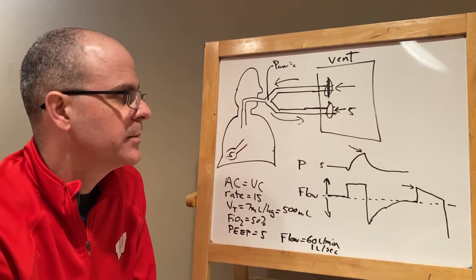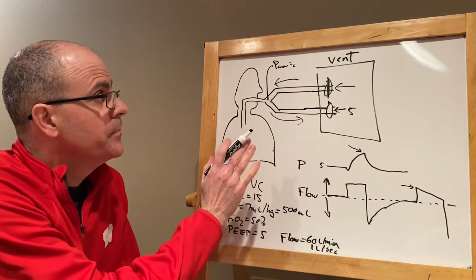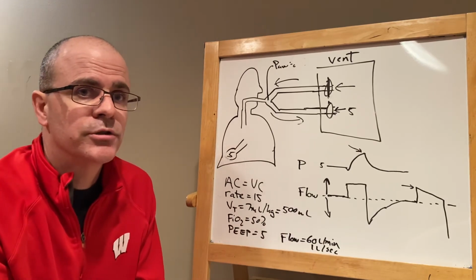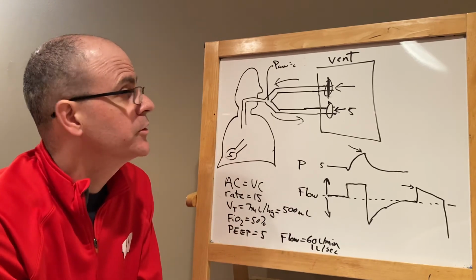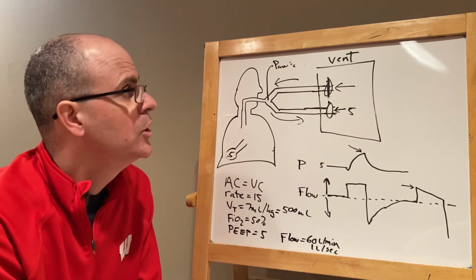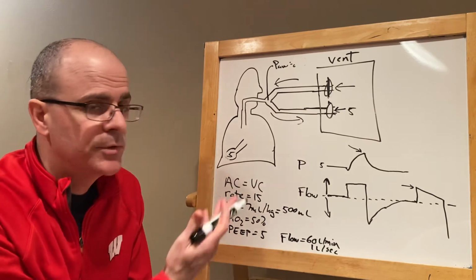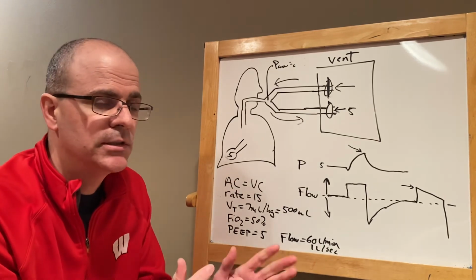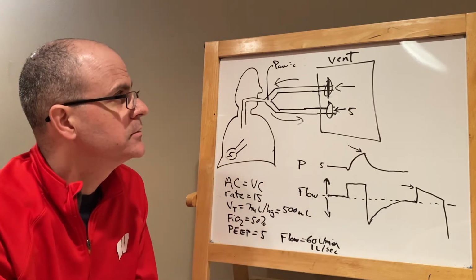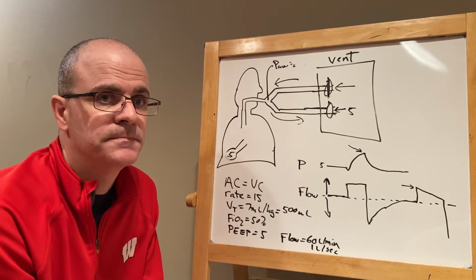And then also I mentioned if you're having the ventilator be triggered by pressure, there are 2 ways to have a ventilator triggered. There's pressure triggering and there's flow triggering. We tend to use flow triggering because there are a number of advantages, but I describe this with pressure triggering because, again, I think it's just a little easier to conceptualize when you're new to it. Later on in a different video, I'll describe the differences and why we usually use flow triggering.